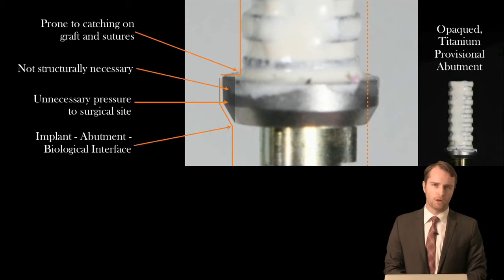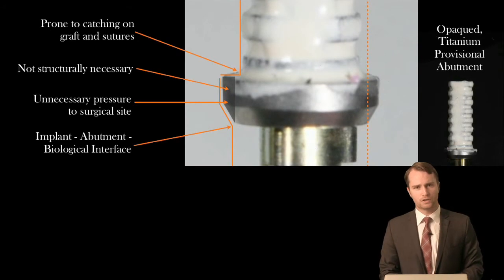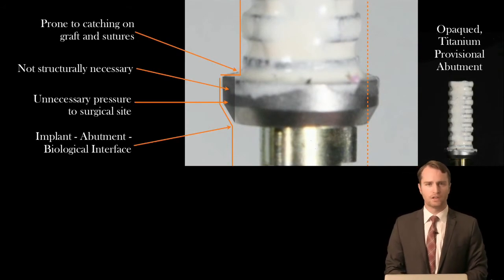Typically, we're going to have the bone, the soft tissue, the head of the implant, and the junction of the abutment all coinciding at that one point. The last thing we want at that junction is a change in contour, which will lead to bacterial accumulation, possible inflammation, and possible bone recession and gingival recession. So our modification of this abutment is fairly straightforward.